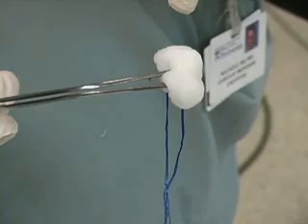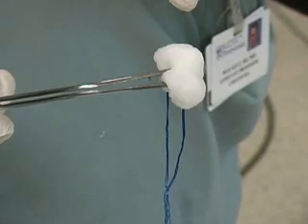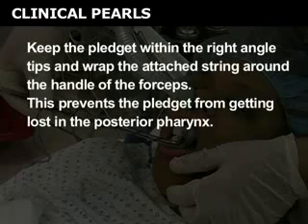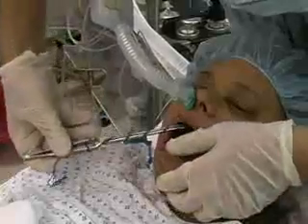Place 2 cotton pledgets soaked in 4% lidocaine into right-angle forceps. Keep the pledget within the right-angle tips and wrap the attached string around the handle of the forceps. This prevents the pledget from getting lost in the posterior pharynx. Place the cotton pledget into the patient's mouth.